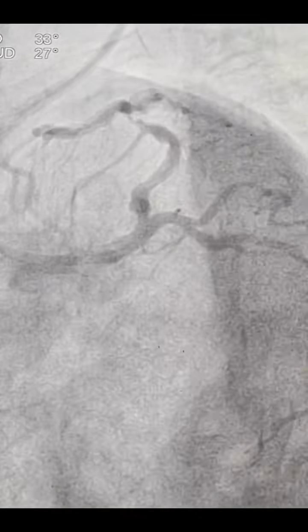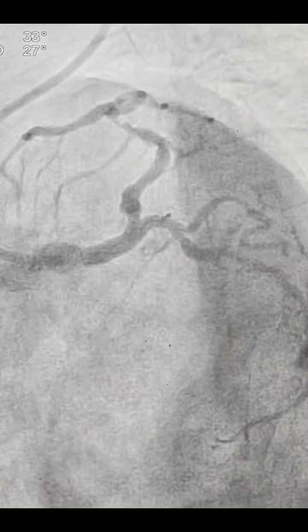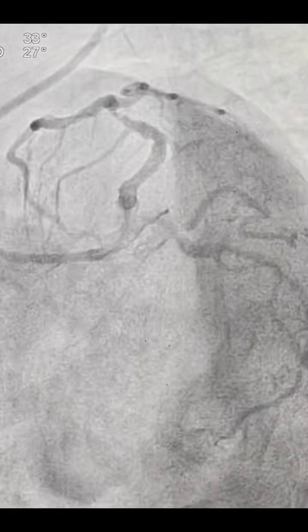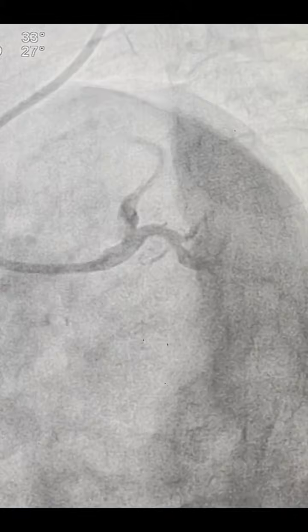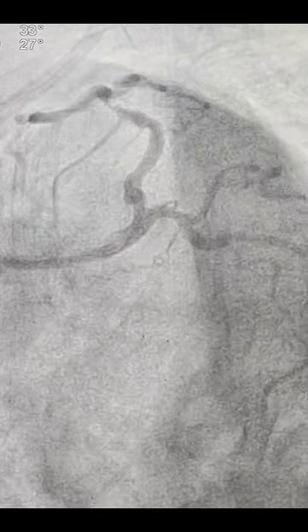After obtaining all the clearances, the patient was taken for angioplasty. We proceeded with the same route. You can see the lusoria is there, but somehow I managed to negotiate the catheter and hook the left main. This is an XB 3.0 catheter, 6 French.